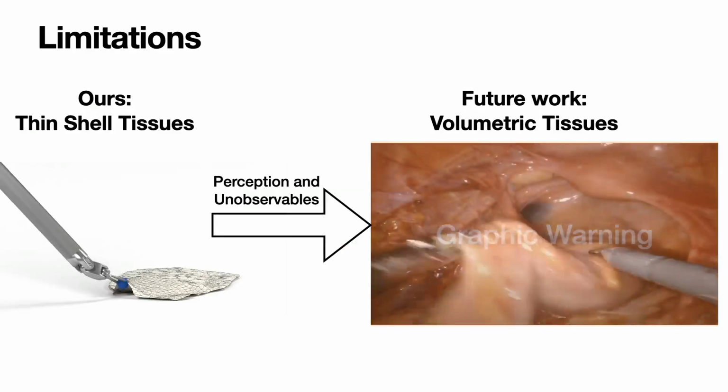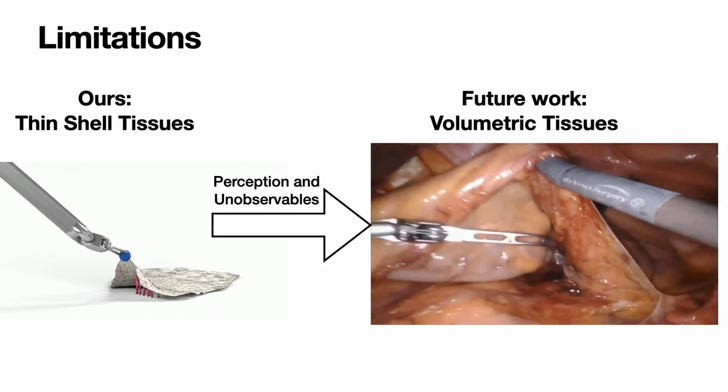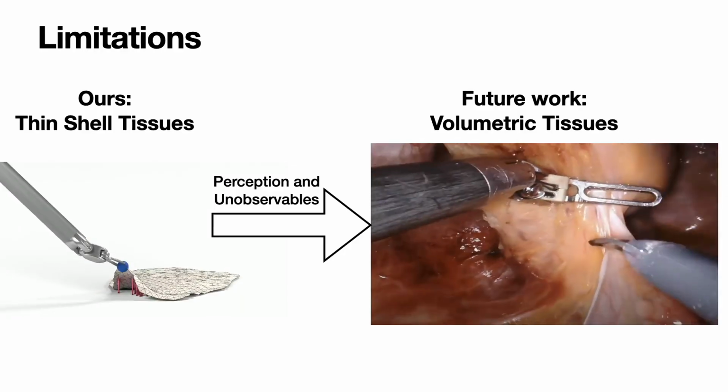Despite its success, our method is still limited to thin shell tissues due to perception challenges like volumetric occlusion and unobservable internal 3D structures, leaving room for future work.